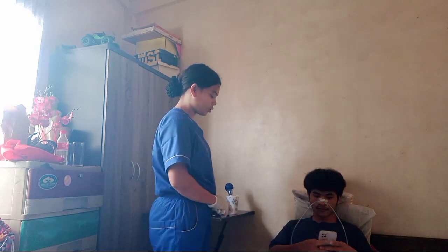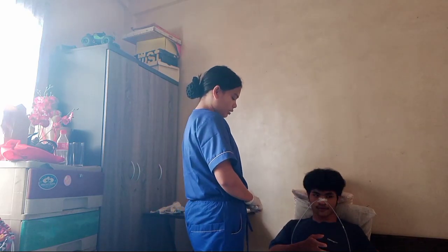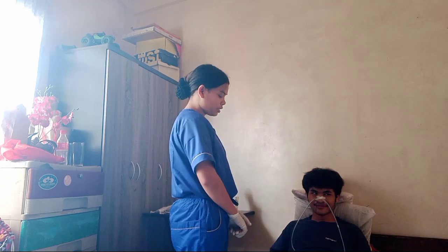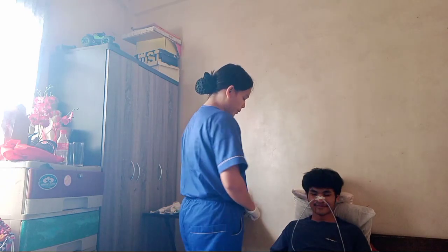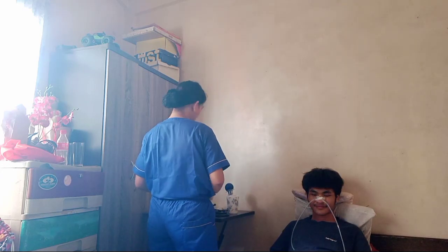So now we will proceed to the lavage. So prepare all the equipment and position the patient to the left decubitus position. Then drape the patient with a towel to absorb any drainage.